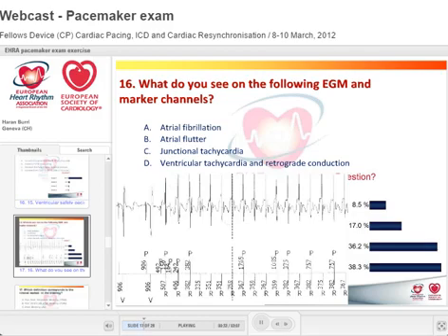and it starts off with a P, a premature atrial beat. One premature atrial beat with intrinsic conduction, because you have an R, a second atrial premature beat with intrinsic conduction, and then what you see is, just after the R, you have a little spike there, which looks like, in fact, an atrial sensed event. It is not seen here, and is seen intermittently thereafter, because it is so close to the R.